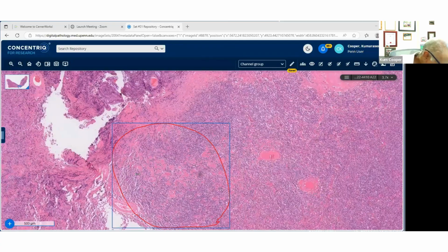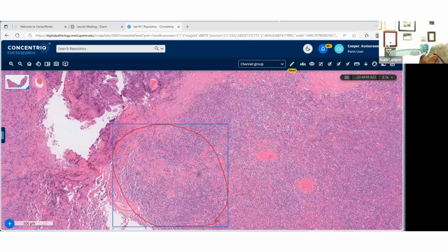All right, any other questions or comments on that EBV-associated inflammatory variant of FDC sarcoma? It was also known as inflammatory pseudotumor-like. That's what John Chan called it in the early days. But I think now the WHO is using EBV-associated inflammatory FDC. So keep an eye out for those. You might find them.